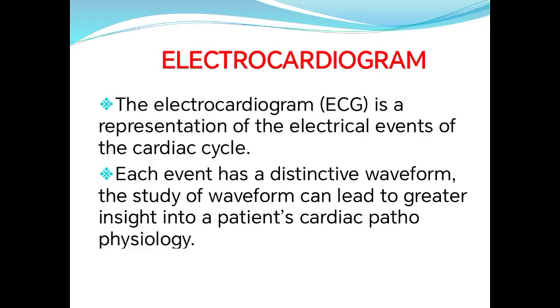So we have to understand this waveform: its duration, its shape, its elevation, inversion and depression. Like that, we are going to diagnose most of the problems of the heart that can be diagnosed using the ECG.